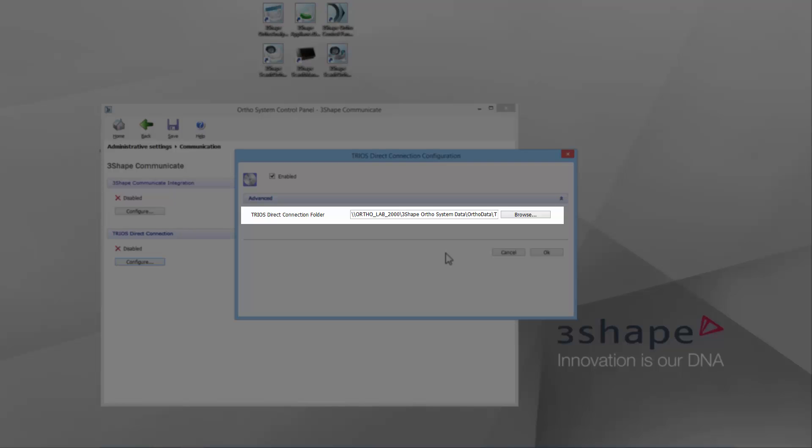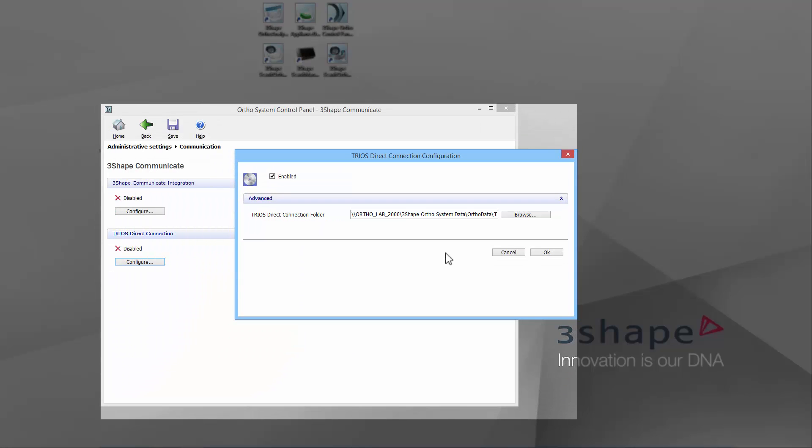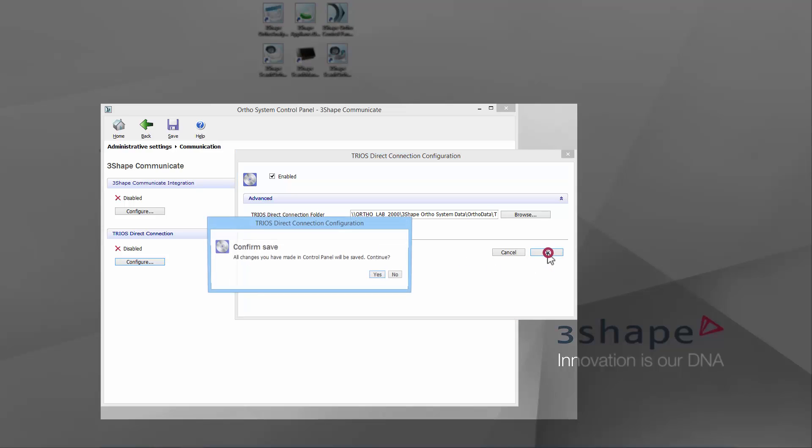The path for the Direct Connection folder will be created automatically by the software. It is important that you know this path, for you will need it to set up Direct Connect in TRIOS. When you've finished, click OK and Confirm to save changes.